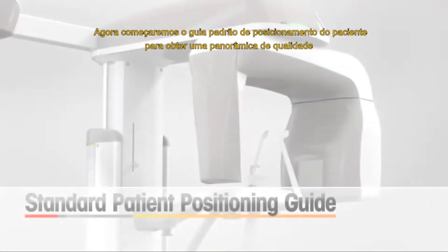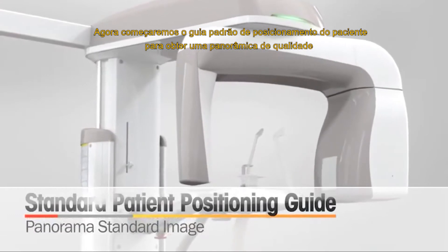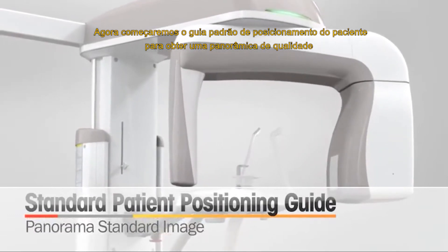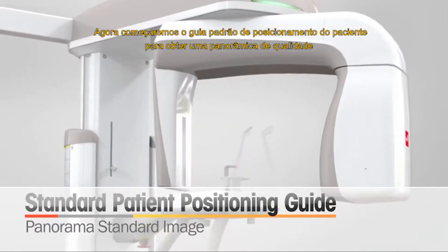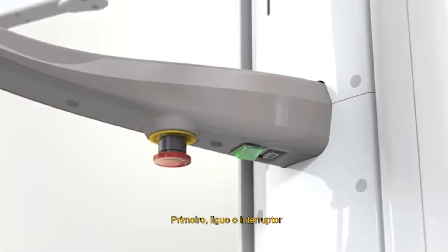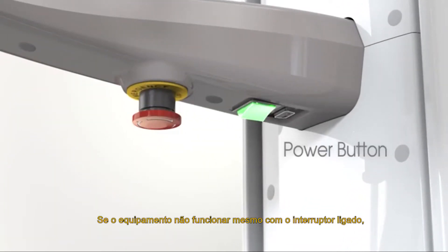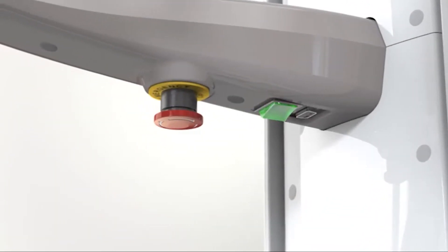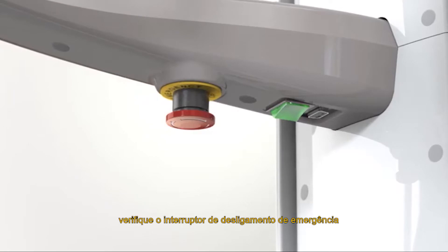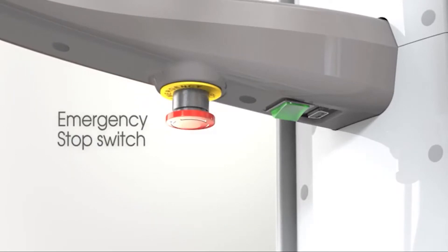We start the standard patient positioning guide for panorama standard image. First, please turn on the switch. If the machine is not working although the switch is on, please check the emergency shutdown switch.